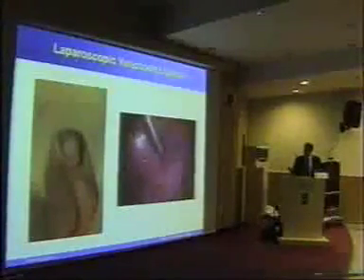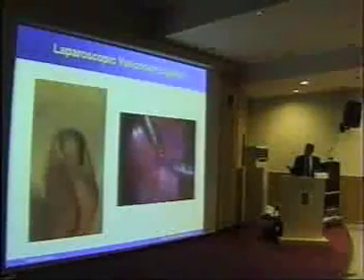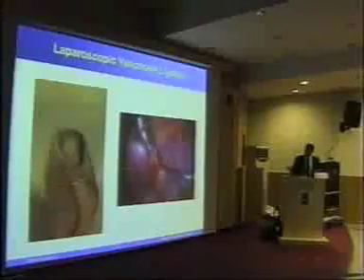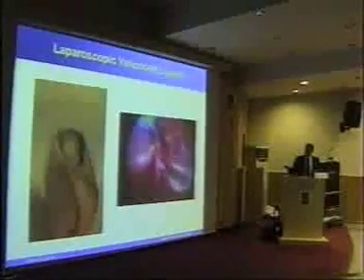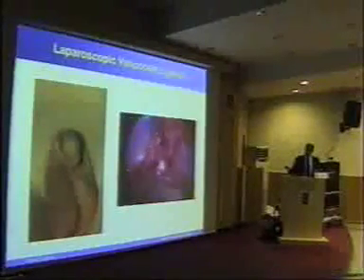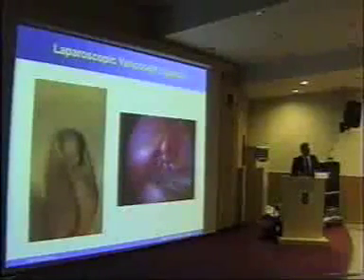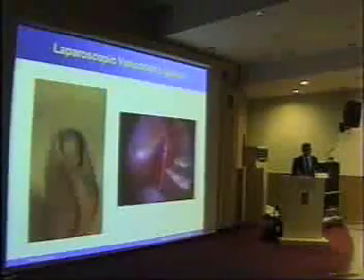Varicocele ligation we're going to do later. Here's a patient with a varicocele. We can see now what we're doing is we're mobilizing the testicular vessels. Actually, this is a different patient. Obviously, that's the right side. This is the left side one looking from above. These are the testicular vessels, exactly the same as for the Fowler-Stevens orchidopexy. You mobilize them and clip them. And I don't separate out the artery from the veins. I clip the lot, and it doesn't make any difference.